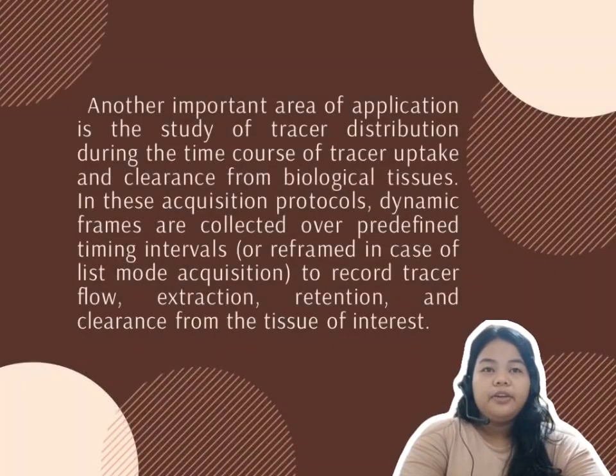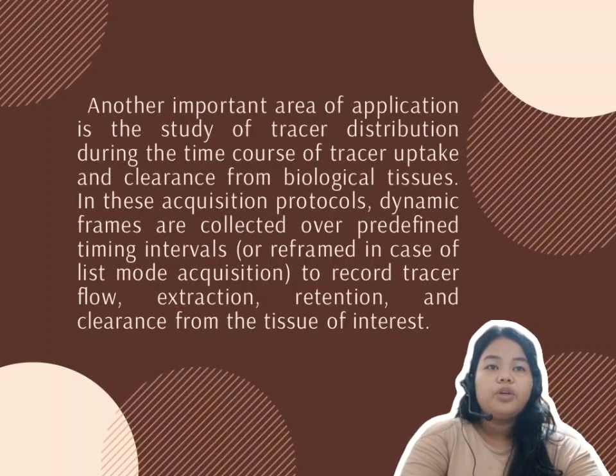Another important area of application is the study of tracer distribution during the time course of tracer uptake and clearance from biological tissues. In these acquisition protocols, dynamic frames are collected over predefined timing intervals to record tracer flow, extraction, retention, and clearance from the tissue of interest.